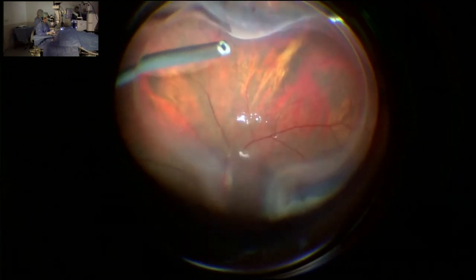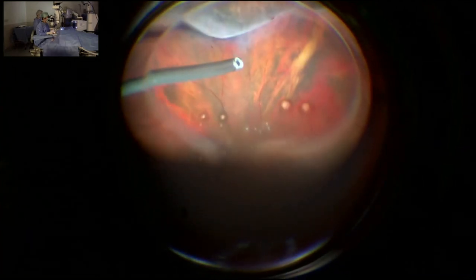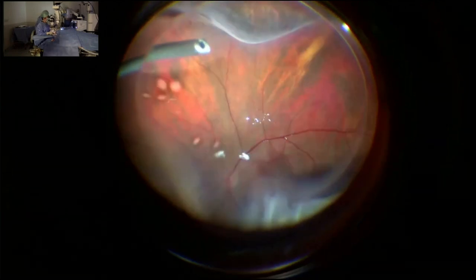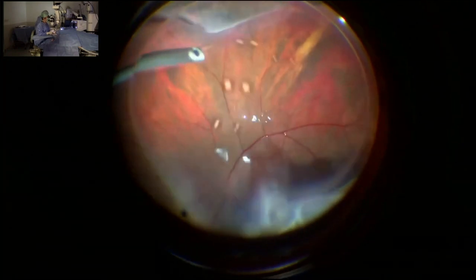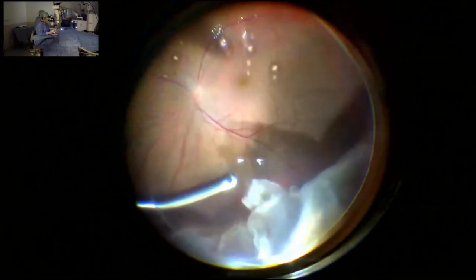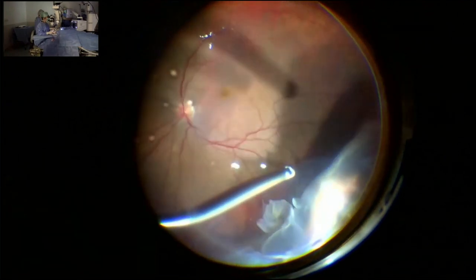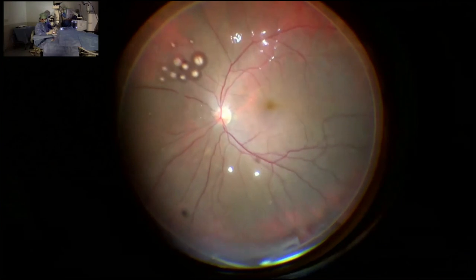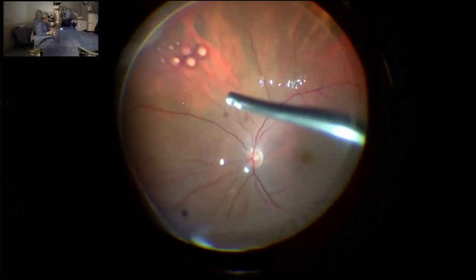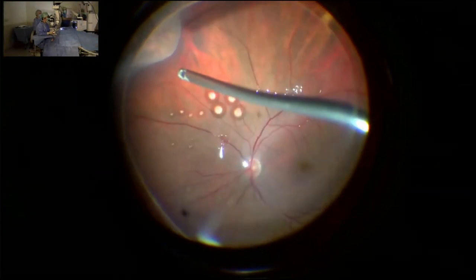So there is no retinal tear in the inferior part of the retina. If you have a question, you can ask me and I can answer, but I will try to explain all the steps. Now we are doing vitreous base cleaning. Also, I use dual linear system during vitrectomy because I like to arrange the cutting rate and also the aspiration rate from my foot pedal. I can change the cutting and aspiration rate from time to time. Therefore, I use dual linear mode of vitrectomy in almost all my surgeries.